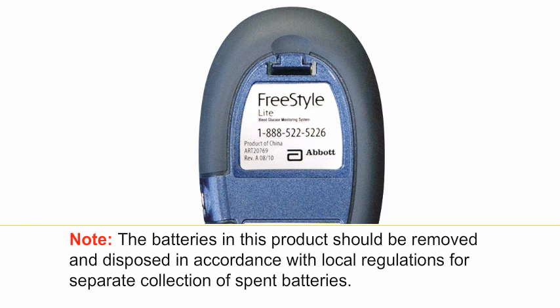The batteries in this product should be removed and disposed of in accordance with local regulations for separate collection of spent batteries.